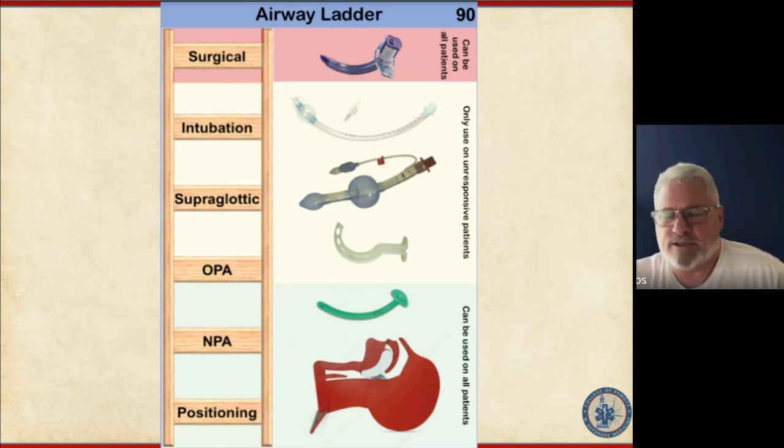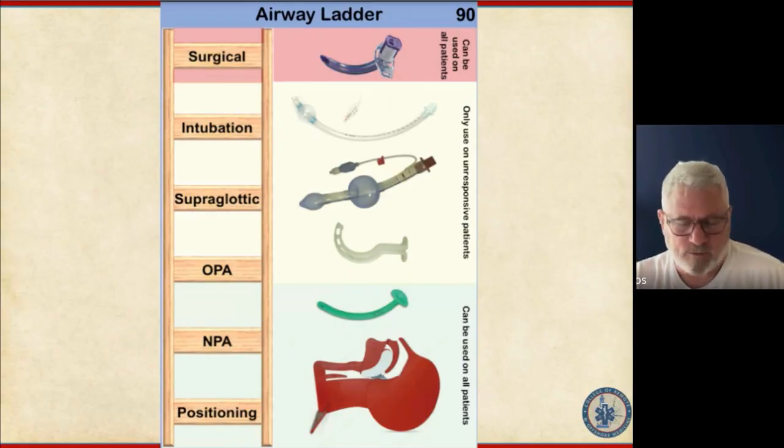I think supraglottic is another thing that it states in the CPG that it's not tolerated. I wish they would have modified that to say that it's rarely tolerated, mainly because if your patient can tolerate an OPA and a supraglottic, neurologically, they're not doing well. But there are people walking around among us in the population that can tolerate something like that because they have a diminished gag reflex. But in medicine, if your patient is in trauma or just that sedated or that degraded that they can tolerate an OPA and a supraglottic, then it's generally not a good neurological sign for them, generally.